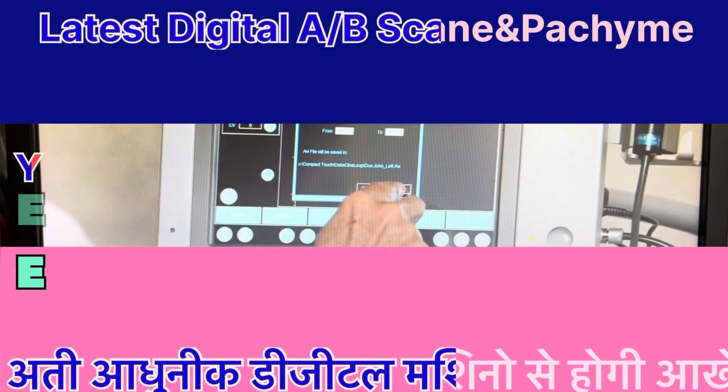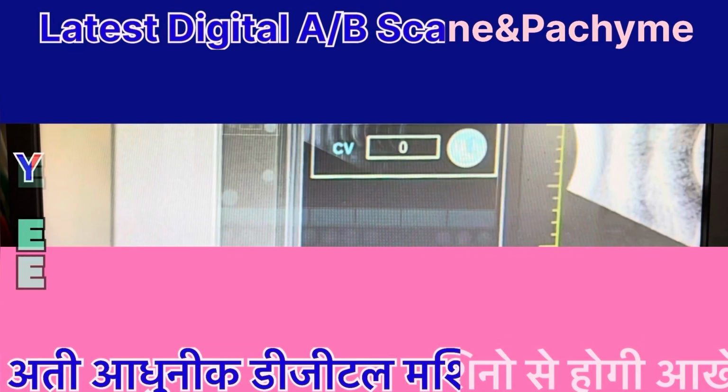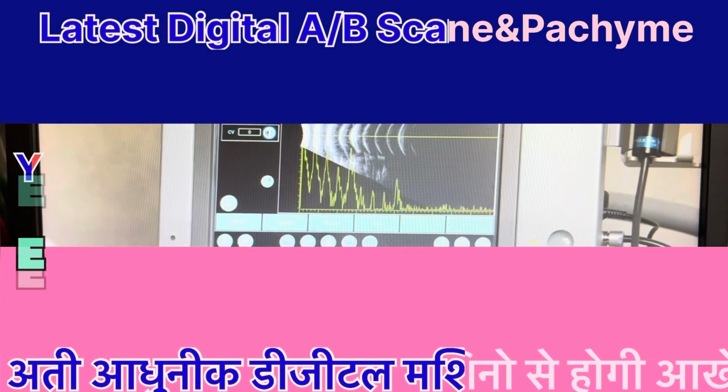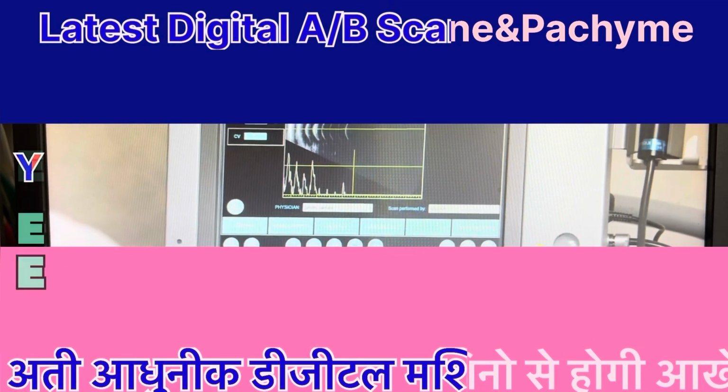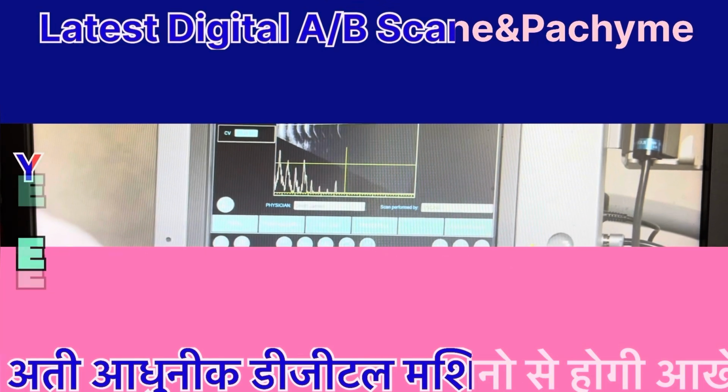The Cineloop function records a 10-second long video sequence corresponding to a maximum of 100 images and is activated with the Cineloop icon. The number of automatically recorded images is shown in the loop field, and the sequence can be saved by selecting the loop save icon.